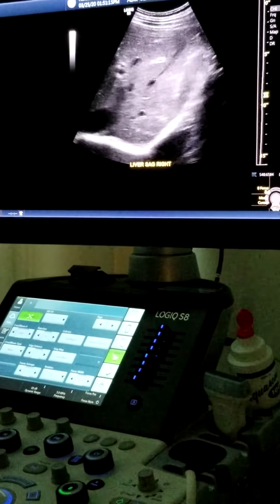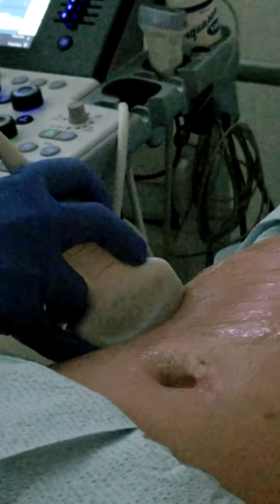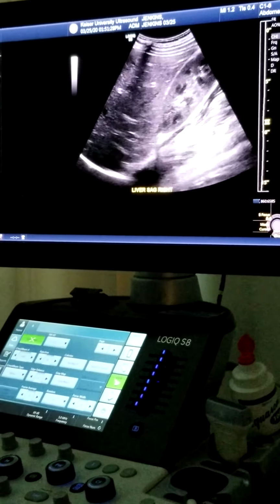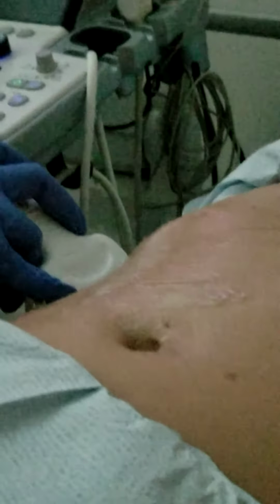So if I go back to following my ribs, you're going to see how it's very rounded. But if I go, sorry, here's the rounded area. If I straighten out my probe, now you're going to see tip to dome. Breathe. I'm not loving that one. Let's do it one more time. Another breath in when you're ready.